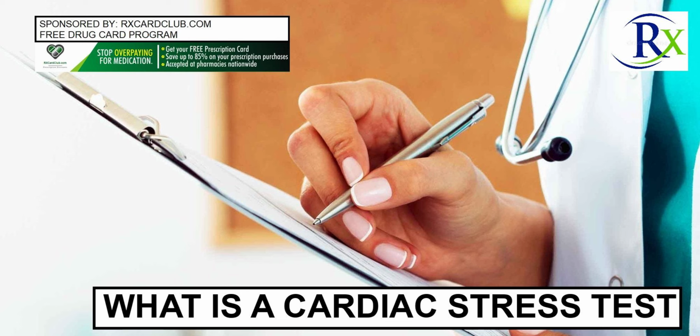Your cardiologist may recommend a more sophisticated form of stress testing, such as an echocardiogram stress test or a nuclear perfusion study, which involves a radioactive tracer injected into your vein during exercise to locate the blockage using a specialized camera. Other considerations. Also, do not hesitate to get a second opinion if you are not getting the answers you need, or to ask your cardiologist to forward your records to another specialist. You can also request a copy of the results for yourself, which can usually be delivered in a digital format.